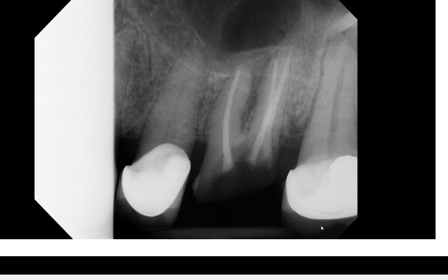I wish we had another periapical radiograph that fully captures the entire length and width of the tooth, but this is as far as it goes back. Does this area look suspicious to you, or does it appear normal?